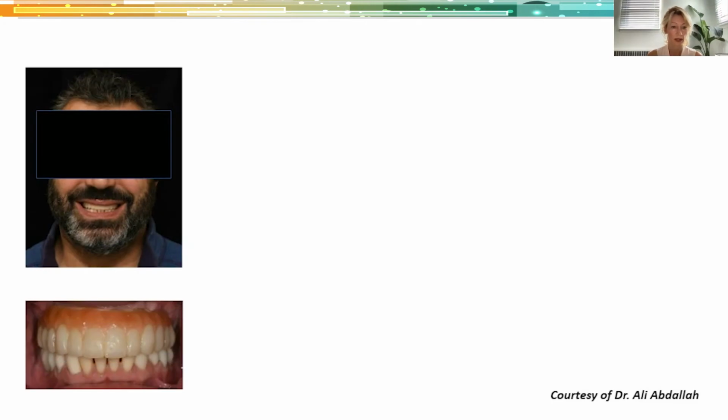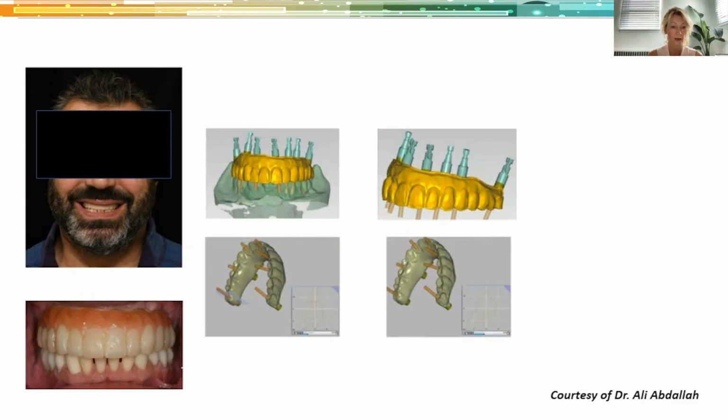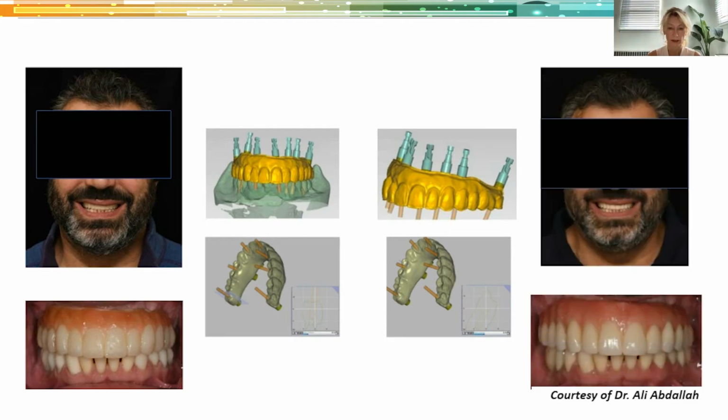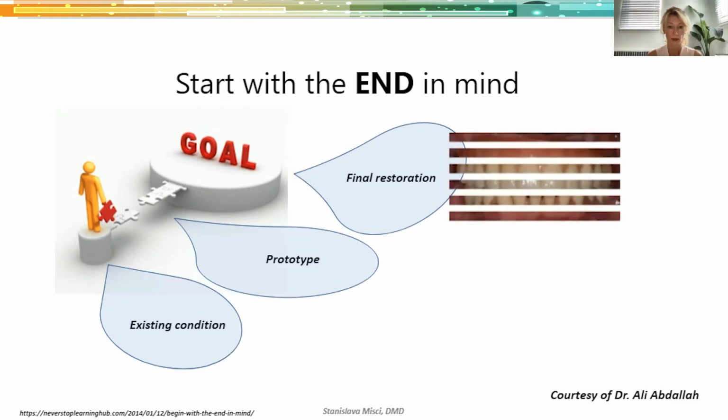And this is the surgery. So now the patient has the temporary prosthesis. As I said, the temporary is our next step as long as everything is good with it and it is based on the proper planning. We duplicate just a cutback and we can have the future restoration made, which is very, very similar to the temporary restoration.